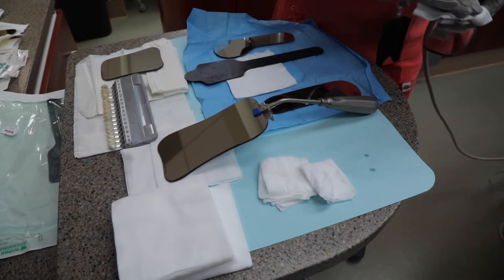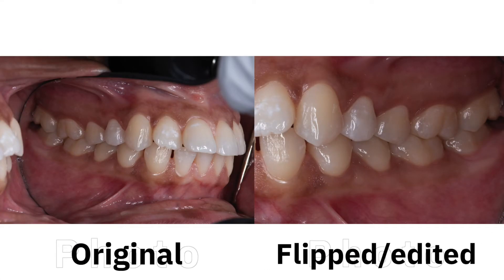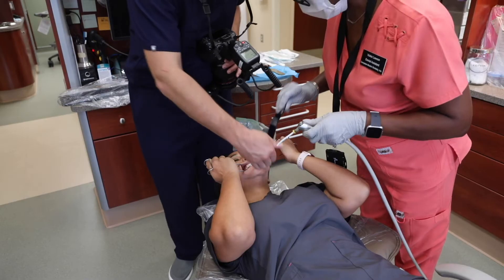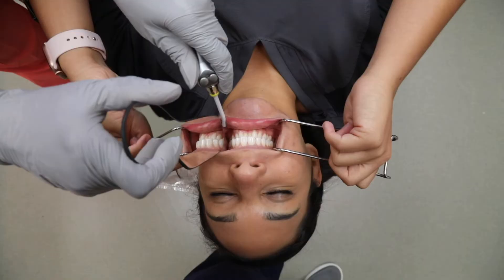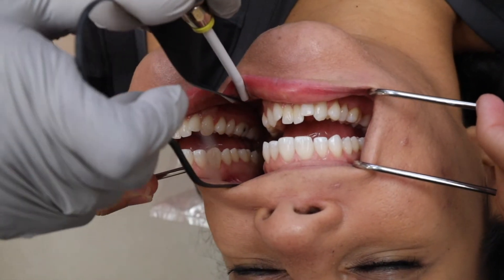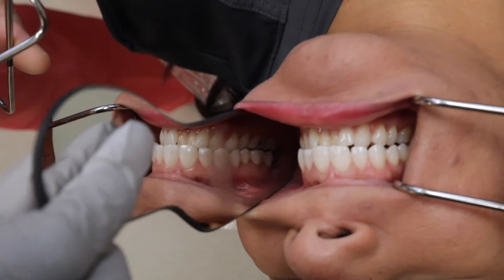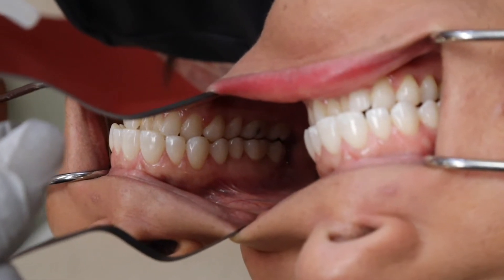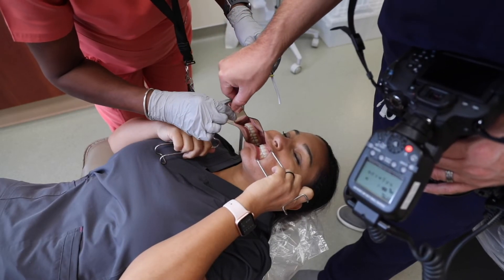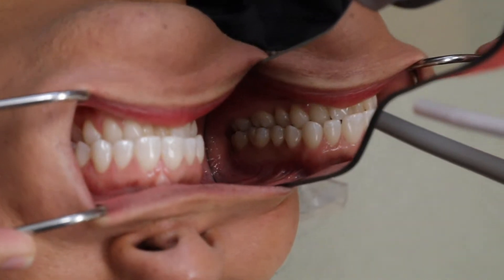Now begin some photos using mirrors. Mirror shots will need to be flipped horizontally when editing since they represent a reflected image. These photos start with the patient retracting with both left and right retractors. The assistant puts the mirror in on the side we plan to shoot, placing it as far back as they can. Once the mirror is in place, the patient removes the retractor on that side. As a tip, before you bring the camera up to your face, try to visualize the shot you want with your eyes first — check the mirror placement, then bring up the camera and take the photo.